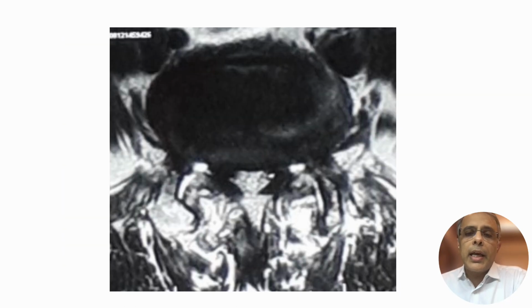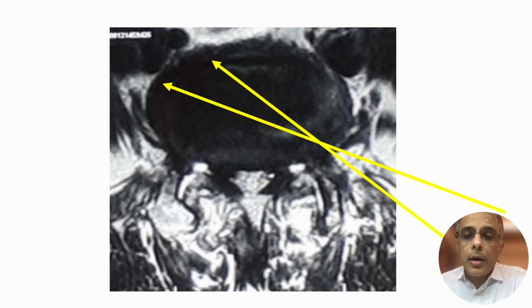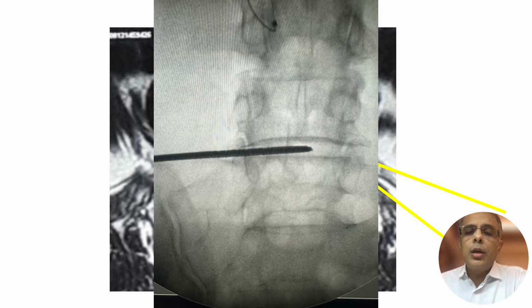Now in certain cases like this, when you have a narrow anteroposterior diameter of your vertebra and broad mediolateral diameter, achieving this angulation, which is ideal as per the yellow arrow, will end up with your needle somewhere into the opposite side, only 1/3 margin, not all the way to the horizontal, because if you want to go all the way to the lateral border on the opposite margin, you will have to go very lateral, and you risk entering into the retroperitoneal space, which is not advisable in most patients, as you may even enter into the psoas muscle. So this is the case.